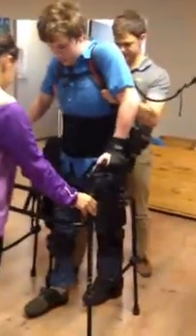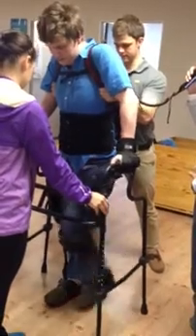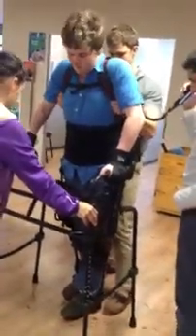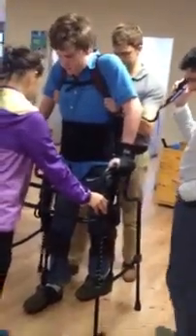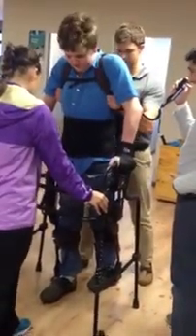That's it. Okay. Then we're going to transfer your weight into your right leg now. That's it. So it's quite a short step. Yeah, it looks longer from... Yeah, that's good. There's a lot of weight down on my back.